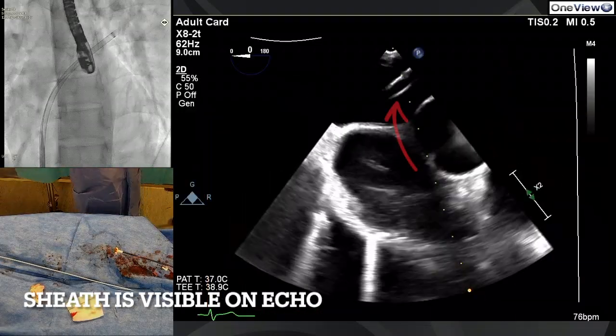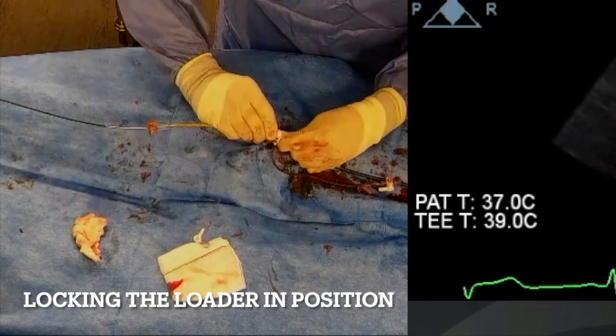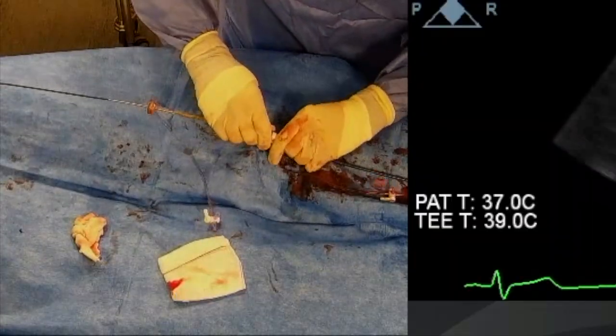So once the dilator is withdrawn, then what we can do is to see the empty channel inside on echo. This is useful because that empty channel means that I don't have to irradiate my TOE operator or the anaesthetist or the patient or myself.